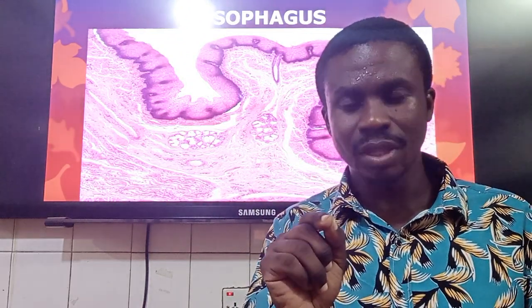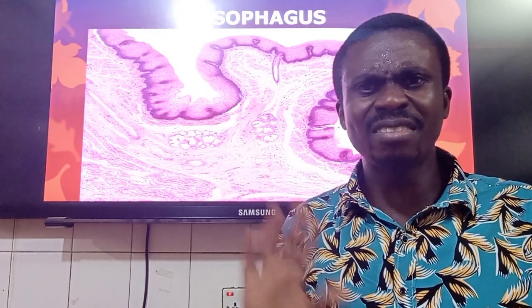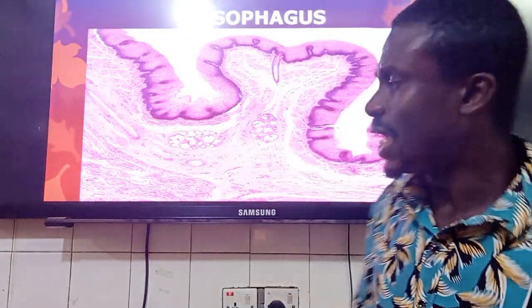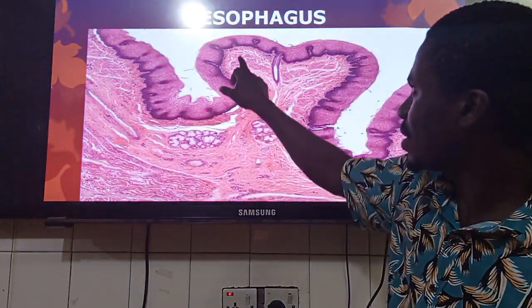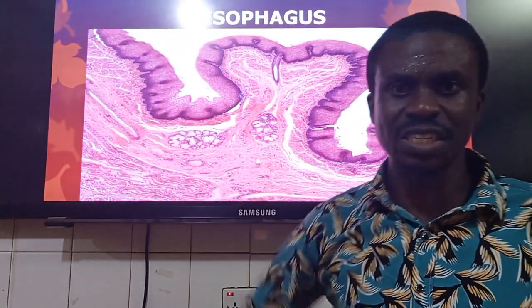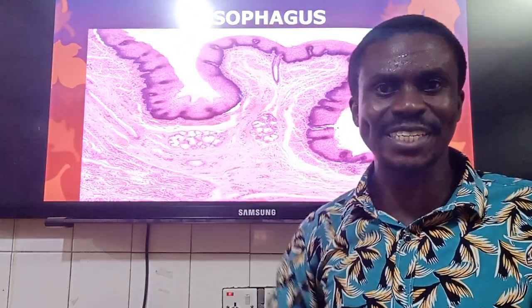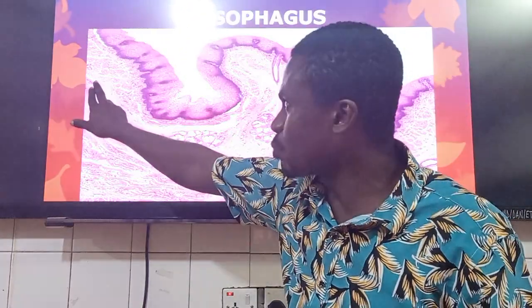However, with the exception of the stomach, where we see these two sections distinctly under light microscopy, anywhere else we normally see just a single layer, and that is the outer longitudinal muscle layer. Now this time you can see that the muscle fibers are broken up into pieces. If they are broken up into pieces, then it tells me that the plane of section was against the orientation of the muscle fibers. So if it's longitudinal and broken up into pieces, then it means the plane of section was transverse. I want you to just appreciate that one. Okay, so that's what we see.